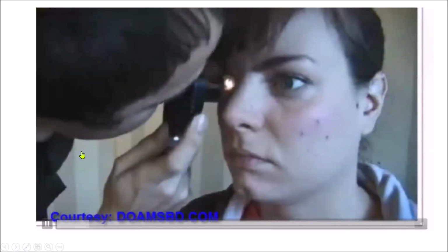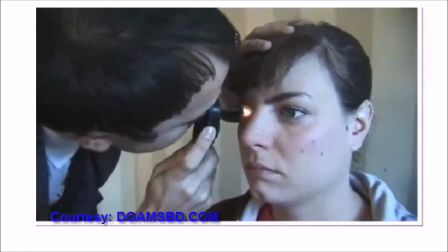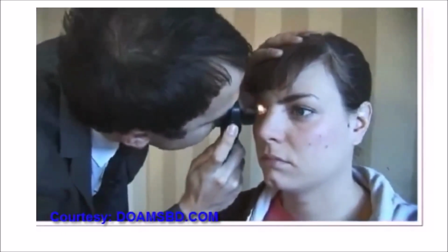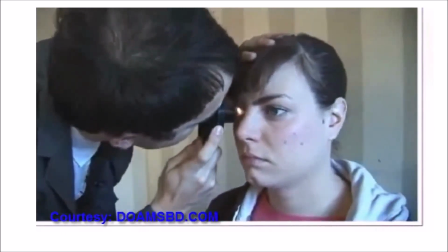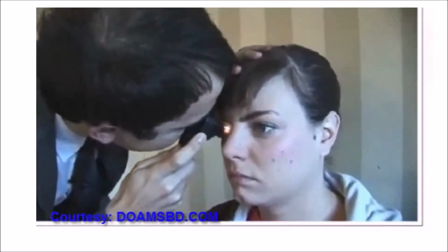You will see just different quadrants of the retina, and the area visible by this light source is called the fundus. Fundus doesn't mean whole retina.